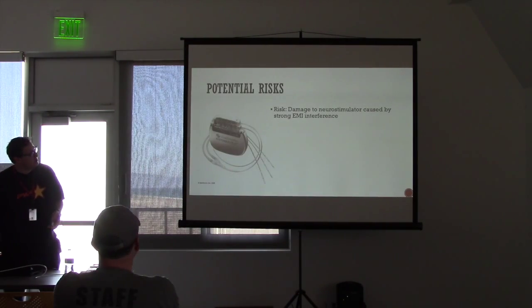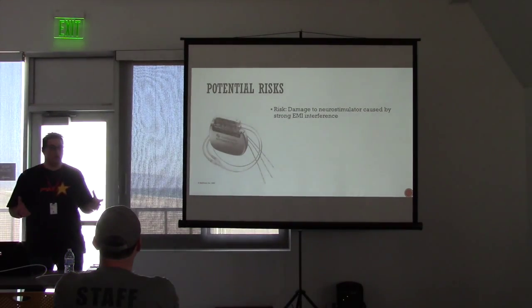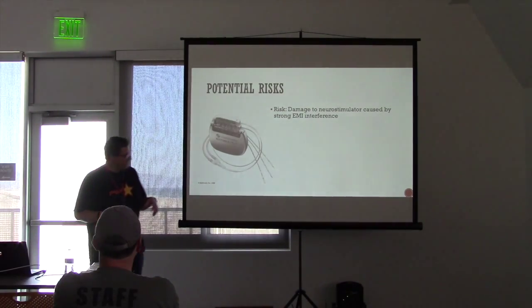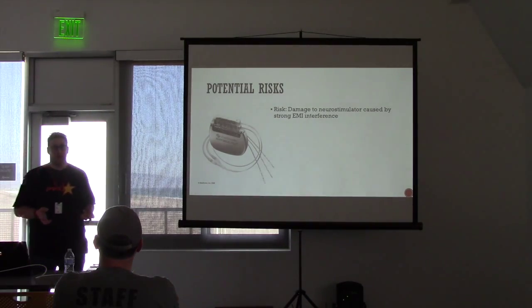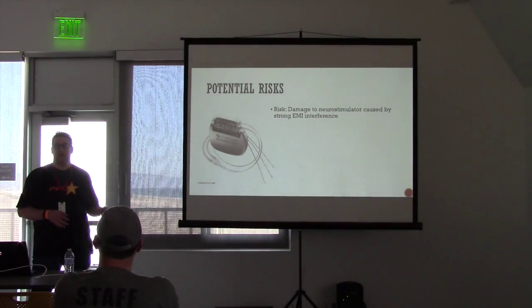So, potential risks. Damage to the neurostimulator caused by EMI interference. There are multiple classes of these devices, and with people who have back problems, one of the things you have to realize is sometimes they need MRIs. Well, if you have a metal device in your back, you can't go get an MRI. So they had to come up with versions of this that had little ferrous material so they could actually put it in a state where you could go get an MRI.